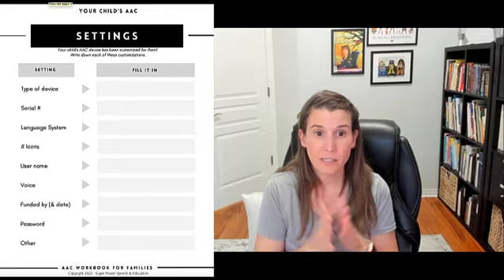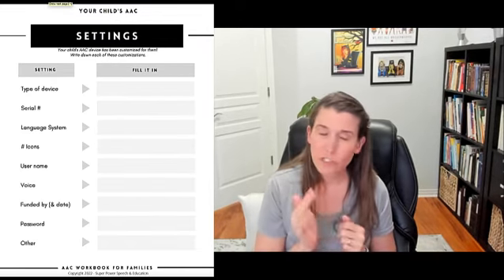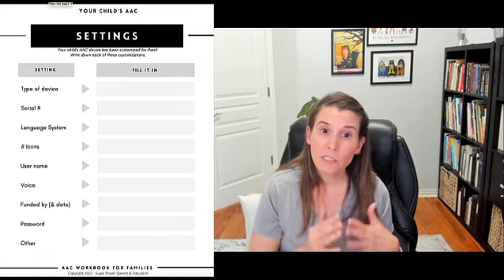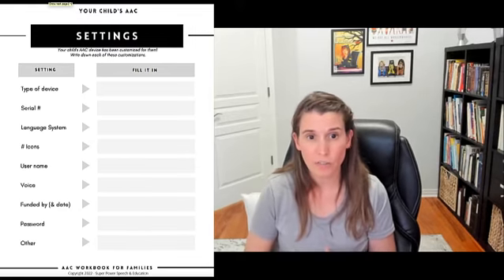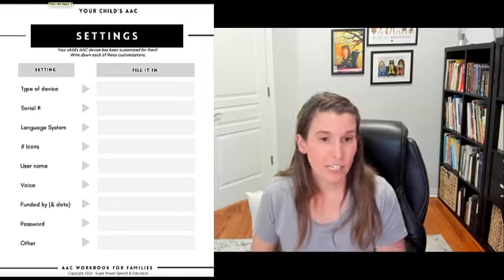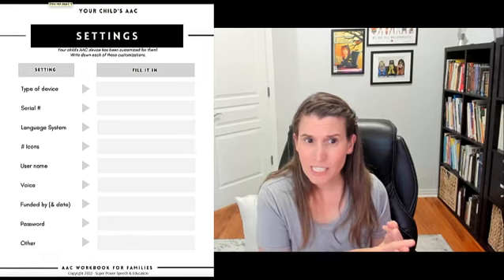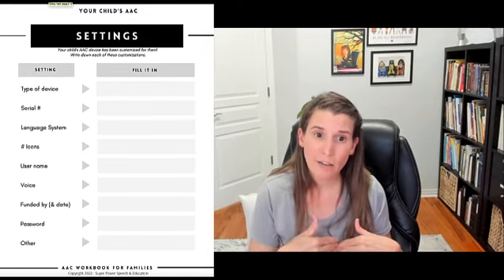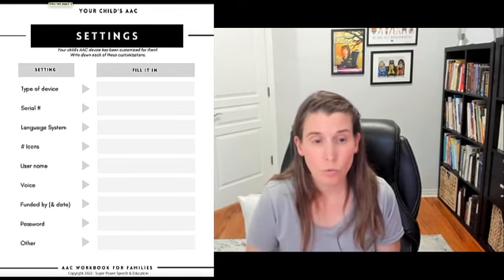Okay, so now we're going to talk about settings. Now, this is something you kind of got to play around with or get some help. If you're not sure where to go, definitely get some help with these things. But you need to know, or at least have written down, all the different settings for your child's device. And the reason is because things happen. The device gets broken, the device stops working, or it ages out and you're ready for a new device, right? And so you need to know exactly what your child has so that it can be reproduced or put into a new system.